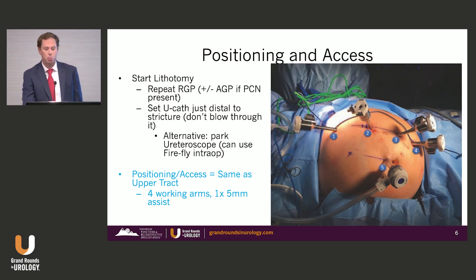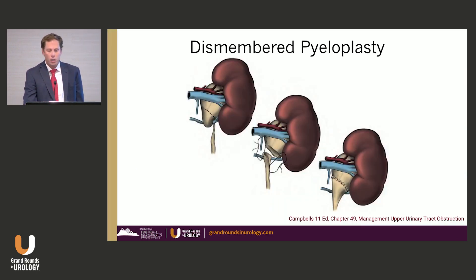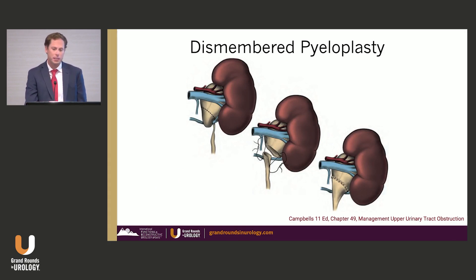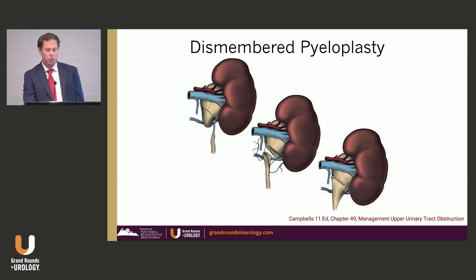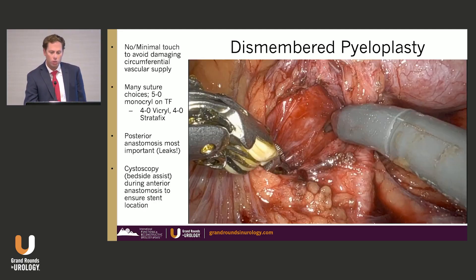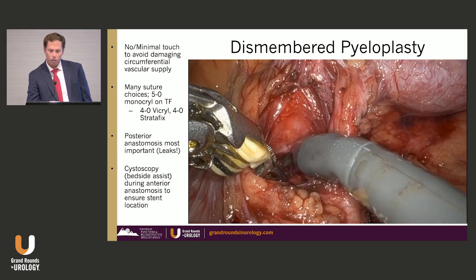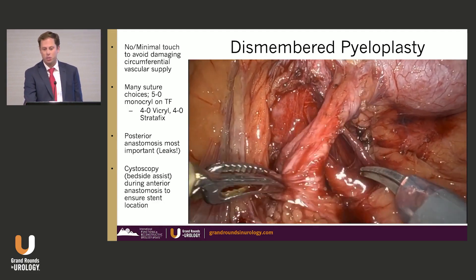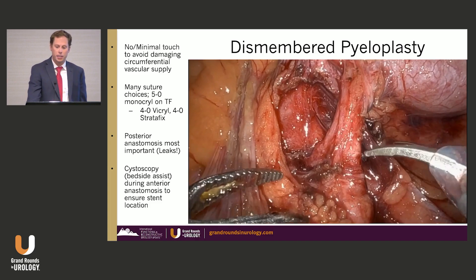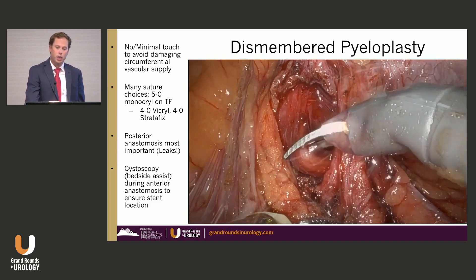You can use the light from the ureteroscope under Firefly, which can sometimes help with localization. The classic Anderson-Heinz dismembered pyeloplasty — as most have seen from Campbell's — involves a crossing vessel that has pushed your UPJ posteriorly. You make an incision, transpose the ureter anteriorly, and put it back together. In this video, we have our lower pole artery dissected out, and we can see where there's an obstruction as we come across the ureter.